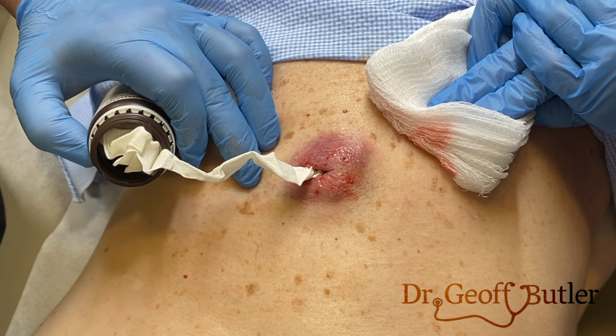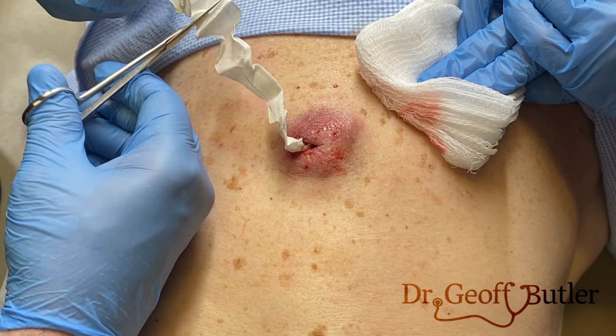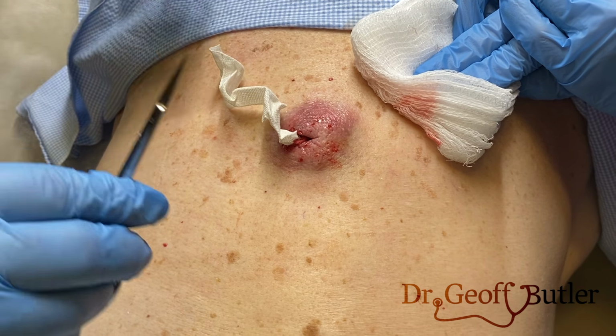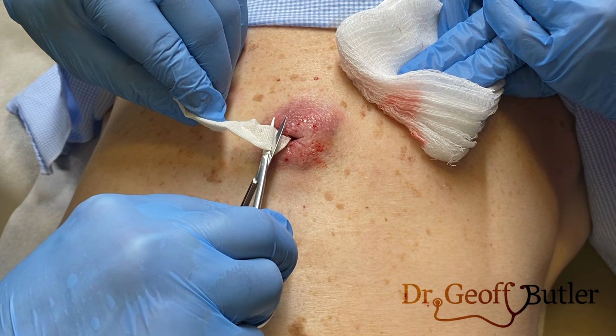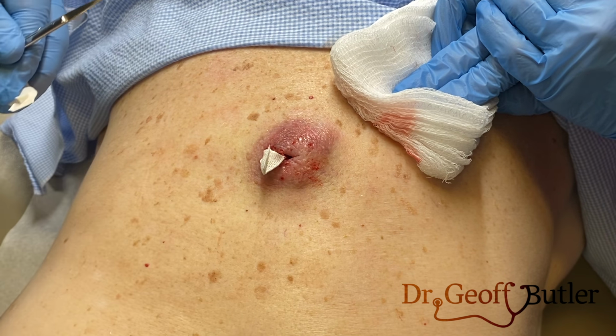Just like that. And here what we do, I'll cut it at the superior end before I get my scissors dirty. And I'll leave that there. And then down here, I'll cut it. And so now if it does get dirty with the scissors, I haven't compromised this. So now we'll just dress this up and we'll see her tomorrow.